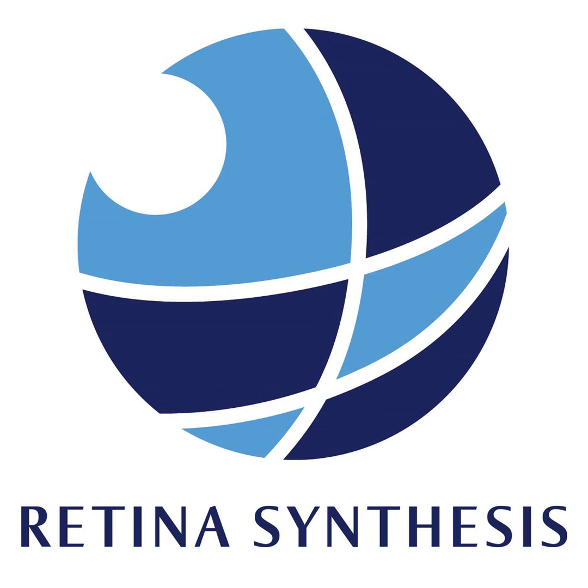So you can identify the RPE layer, you can identify the inner and outer plexiform layer, and you can use it to help identify the choroidal layer. So with Ricky's help, we published on all these different layers, and now we have a single algorithm that can identify the areas of hyperpigmentation using the optical attenuation coefficient strategy. We can image the integrity of the RPE, and this algorithm allows us to image the areas of what we know are geographic atrophy or these hypertransmission defects very easily. And we can image the drusen layer, the elevation of the drusen over the Bruch's membrane and follow the formation of the hypertransmission defect. So in this algorithm, using the optical attenuation coefficient, we can image all the important stages going from drusen, the hyperpigmentation, to hypertransmission defects.